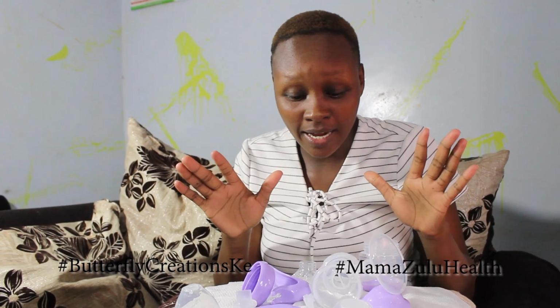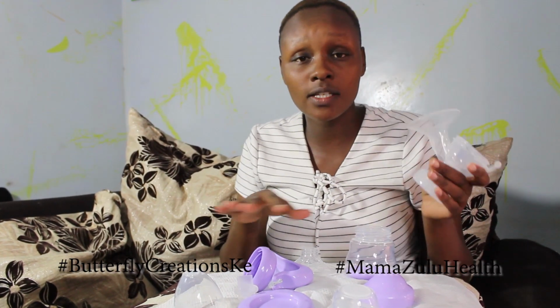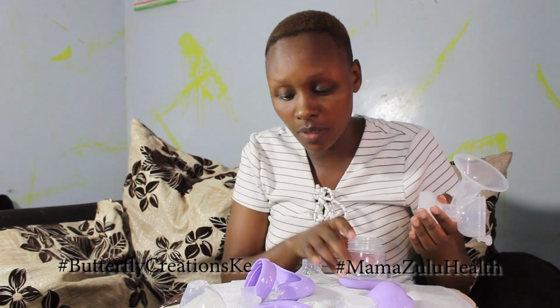So when you buy a breast pump, I usually like using the manual breast pump. I've always used a manual one and that is what I'm comfortable using. So that is what you're going to use today. When you buy it, it's usually like this. You have to assemble all these things. So make sure you have washed all the equipment with warm water, soapy water, and rinse them thoroughly. And then your work surface is very clean, maybe a table or a shelf that is clean. Then your hands should be clean as well.